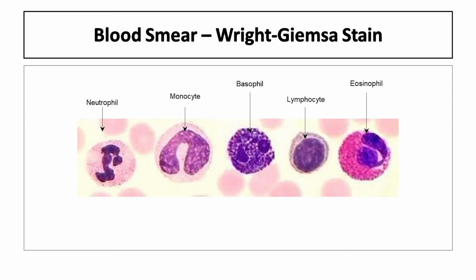So it's very low. One of the other things that you can see in blood smears is platelets. Platelets are the little flecks that you see all around next to the red blood cells. They're pretty easy to identify as well.